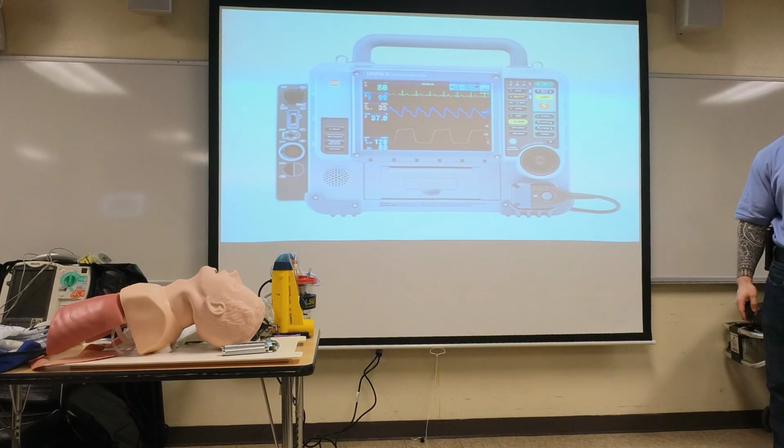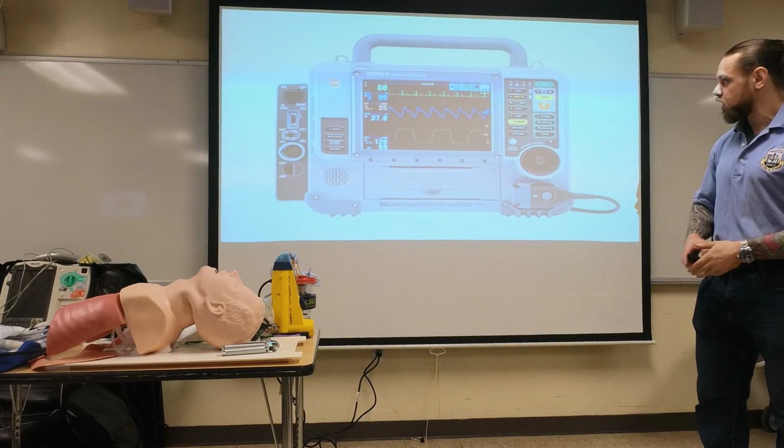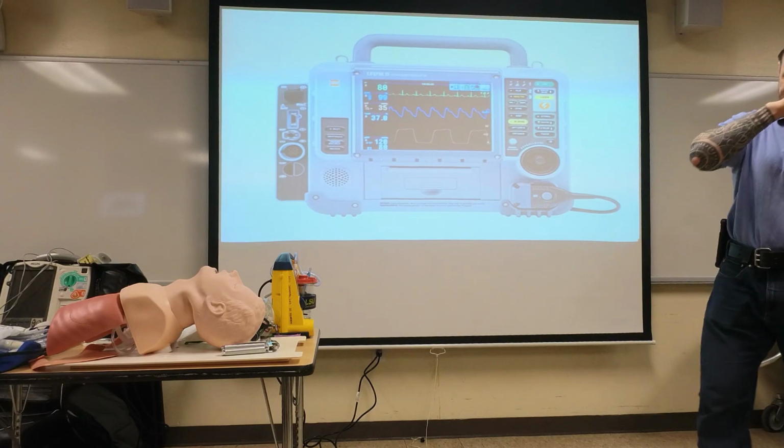So remember we did pre-oxygenation. I'm going to use you again. For this, I actually put up another pulse ox. First thing we're going to do, once we're going to.